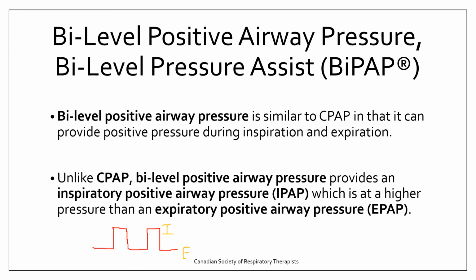It really depends on the type of ventilator that you're using, what kind of pressures that you're going to set. The basics that you have for this mode of ventilation is you're going to have some sort of end expiratory airway pressure and some sort of inspiratory airway pressure, whether that's called IPAP or EPAP, whether it's called PEEP and pressure support. They're going to do the same thing in the end. You just have to be wary of what you're setting and how those settings work.